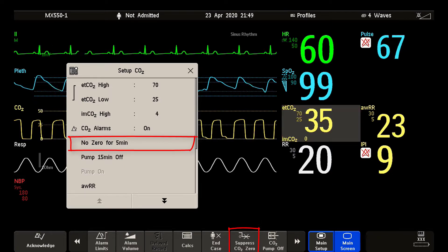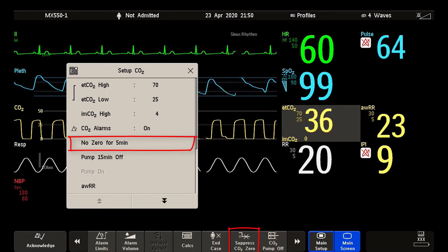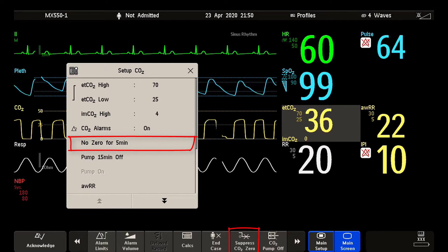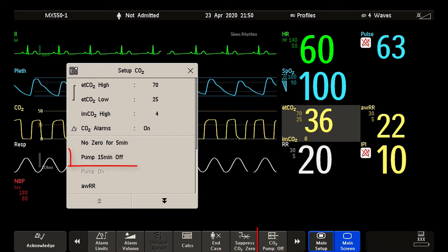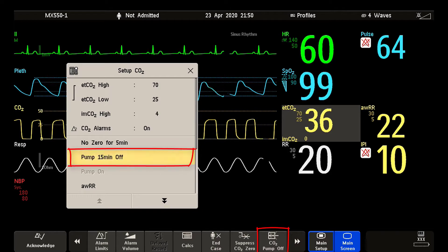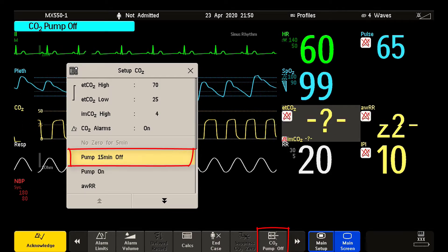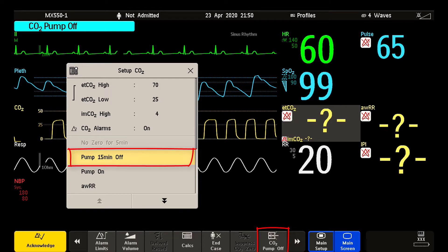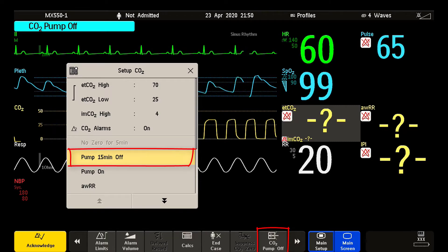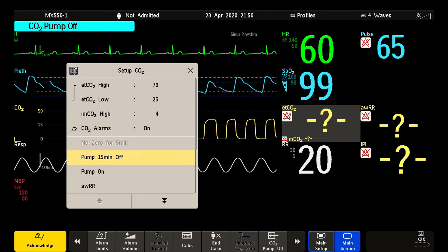This is useful when performing an important procedure that requires uninterrupted CO2 monitoring, like during an intubation. You can also switch off the pump for 15 minutes, and therefore the measurement. Use this when administering nebulizing therapy or during suctioning. You can always resume the measurement before the 15 minutes are due.